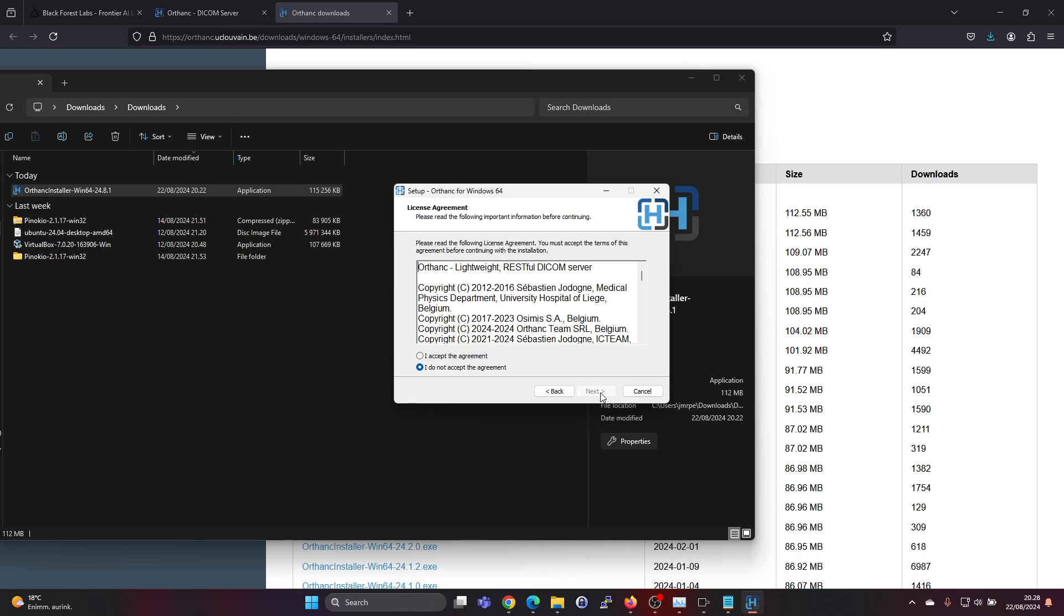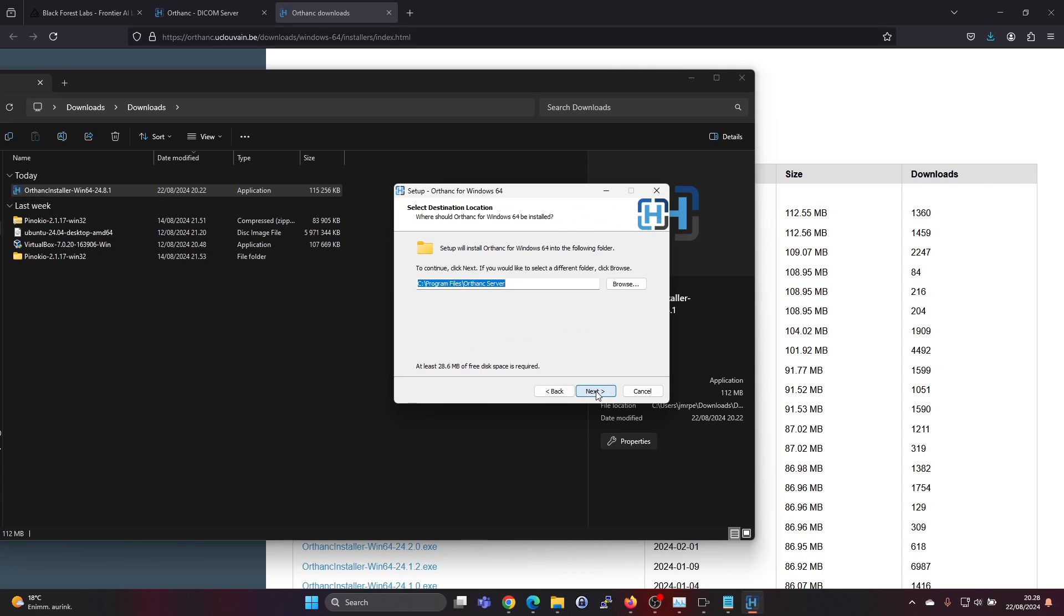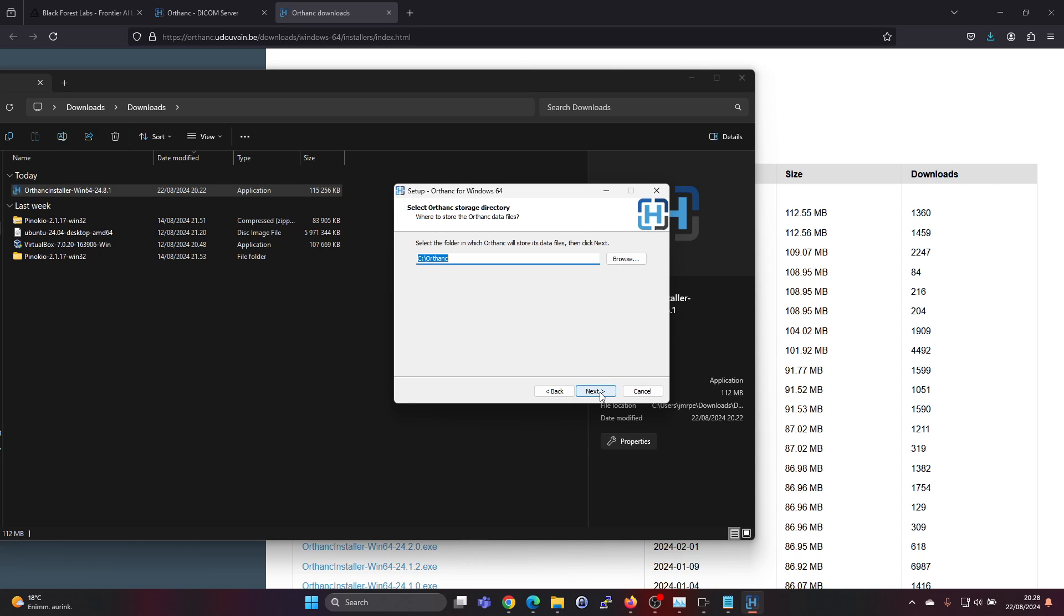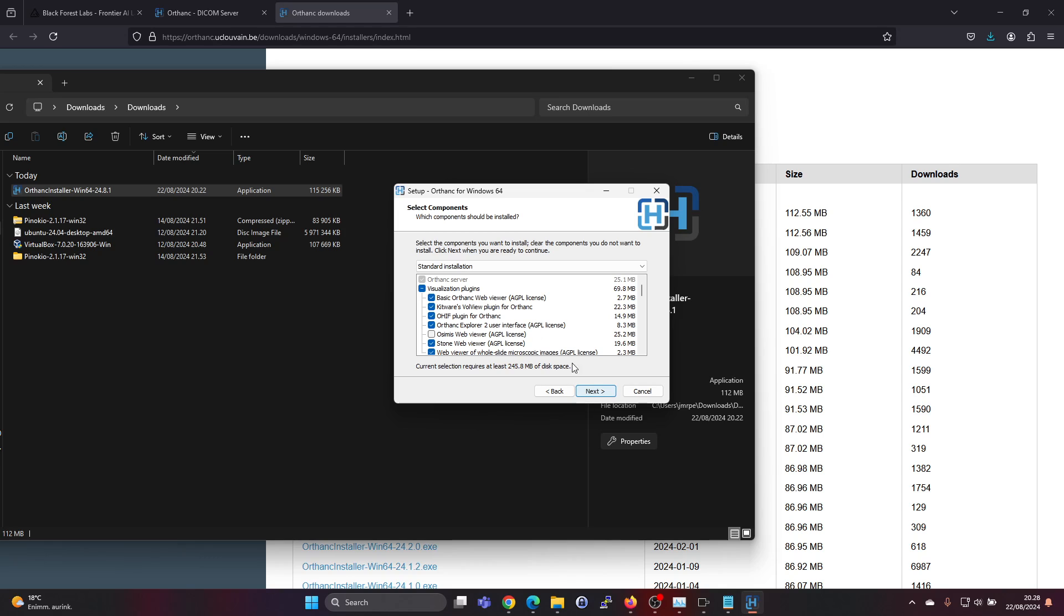Click on next. Accept the agreement. Select the folder. The default is fine. And the data will go to C Orthanc, that's fine as well. You can choose which visualization plugins you want to install.